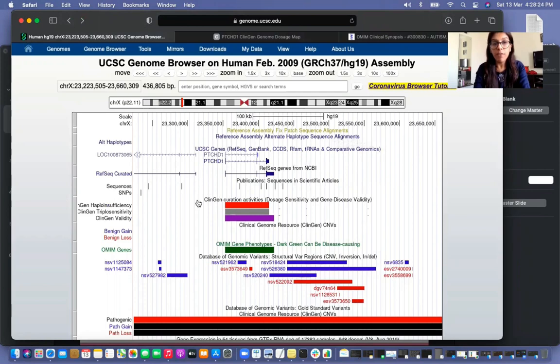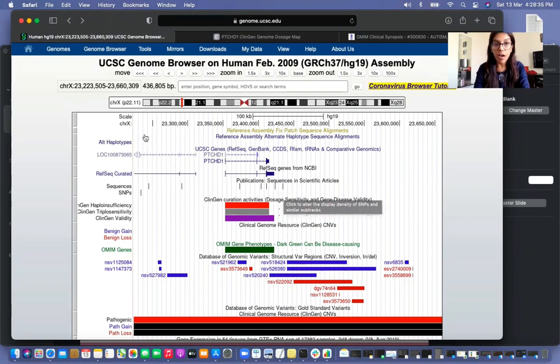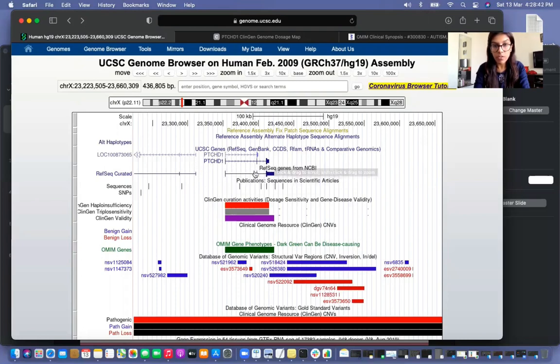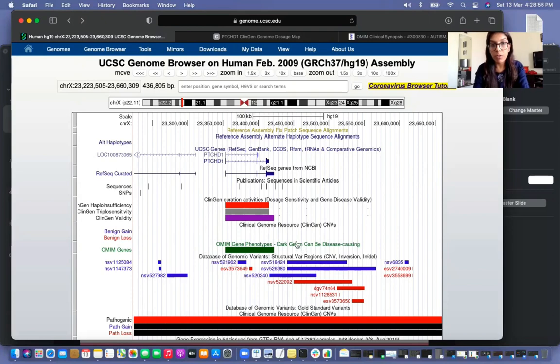Once you do that, click refresh on the UCSC web browser and those tabs will become visible. In our CNV of interest, there is only one protein coding gene, PTCHD1, given by the RefSeq curated gene list from NCBI. Looking at the OMIM gene phenotypes, we can see that our CNV is a disease-causing CNV with respect to OMIM phenotype.